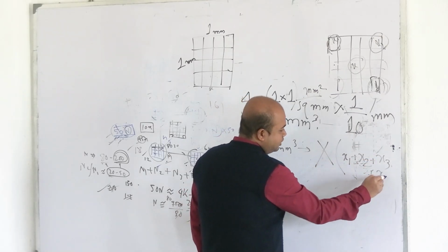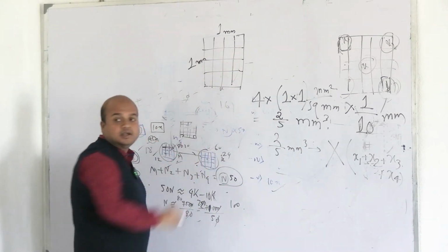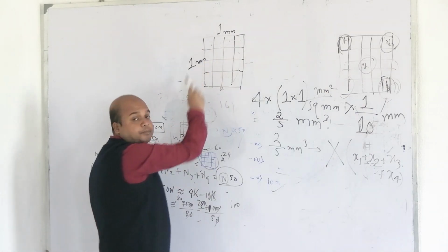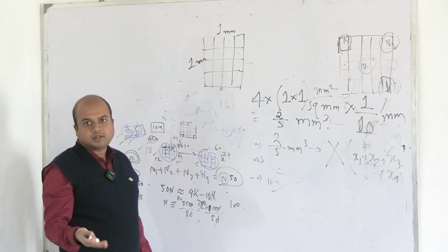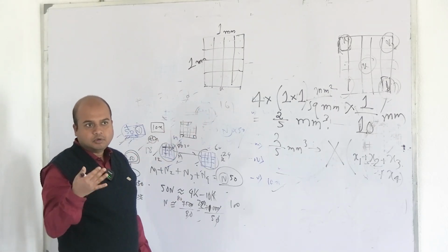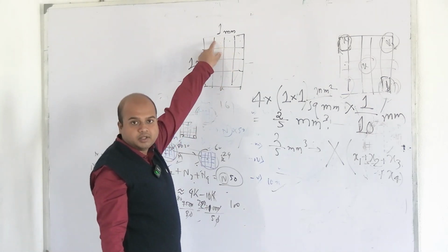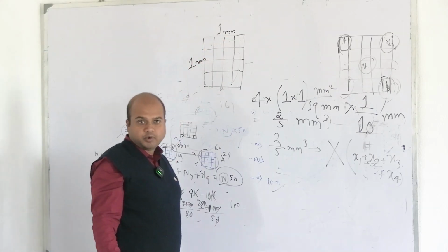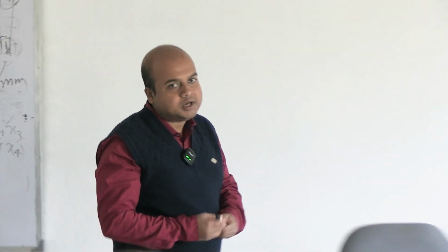And what is the rule of counting? How do we count in case of WBCs? We count this as a whole. Number of cells are less, so it is usually not required that you count these smaller squares separately. With our eyes on the eyepiece lens, we are counting the cells under the microscope, that is, we are counting this whole large square together. It is not usually required that we count the individual smaller squares. If there are more cells, then we may require the smaller squares, but still smaller squares are not usually required.